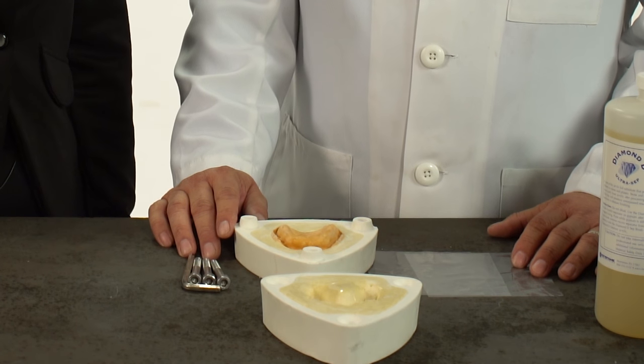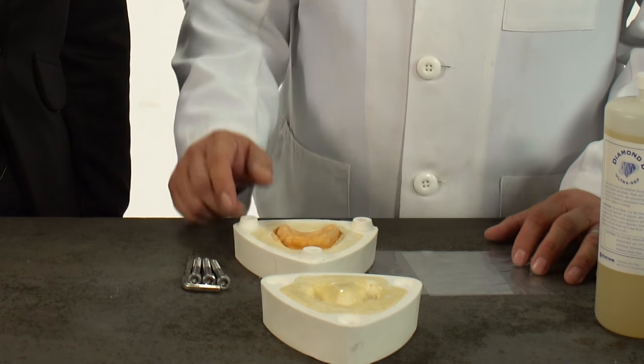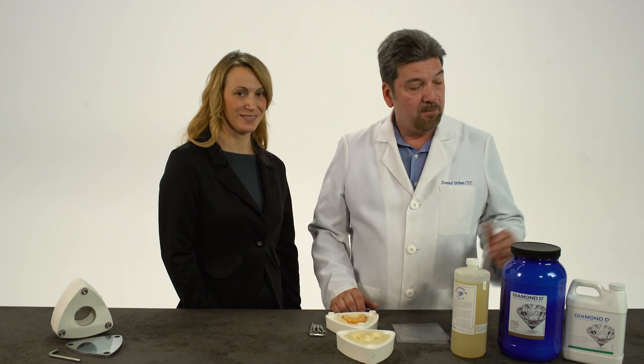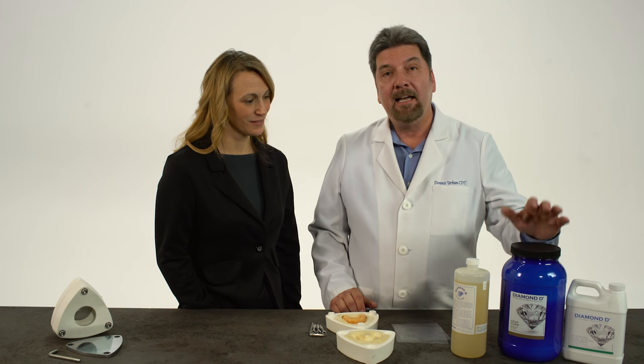As you can see, the case has been invested in a half-and-half mixture of plaster and stone. The case is then placed in the microwave for a minute and a half, and the wax is softened and then boiled out. So what you see here is the case after it's boiled out. After the boil out, all the gypsum areas are coated with Diamond D separator — we coat the entire gypsum area, and this eliminates the sticking of the acrylic to the gypsum. The Diamond D acrylic is then mixed at a 3 to 1 ratio with a 20-minute monomer and Diamond D heat-cured polymer. When the acrylic gets almost to a doughy consistency, we're ready to pack our denture.